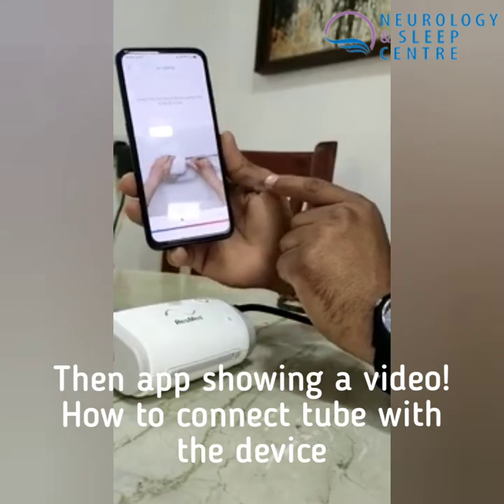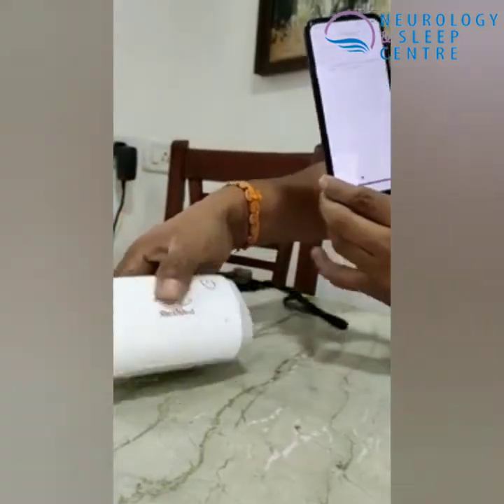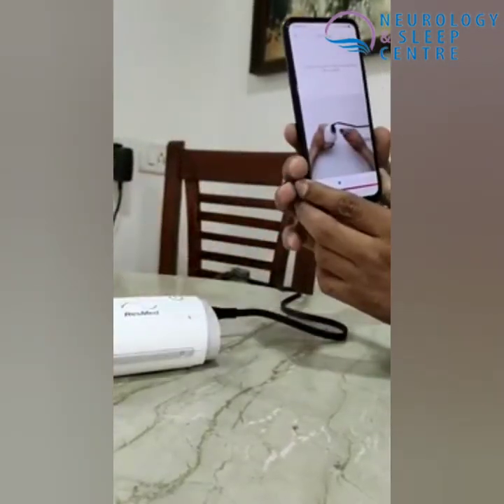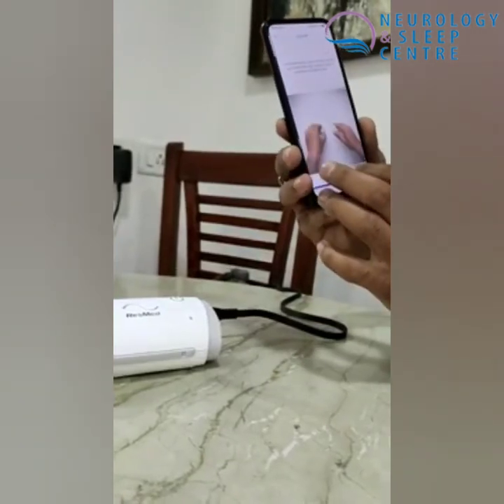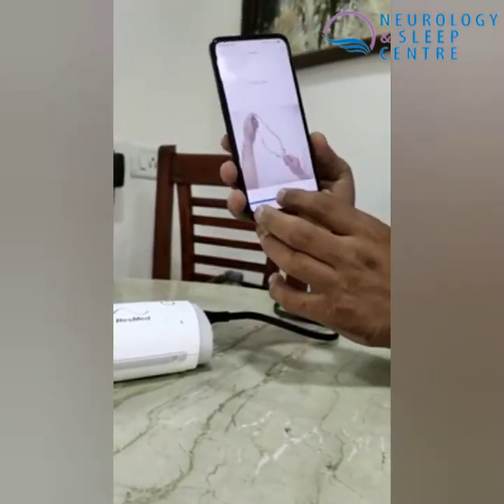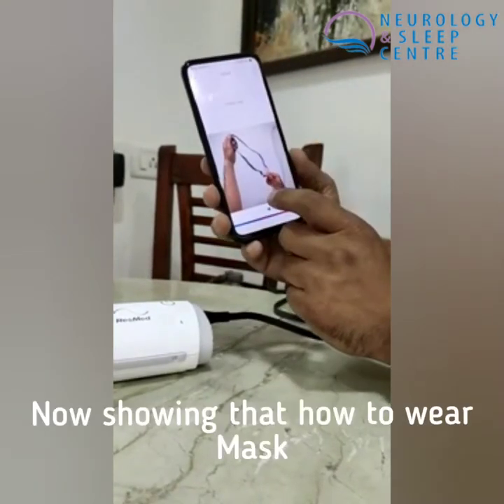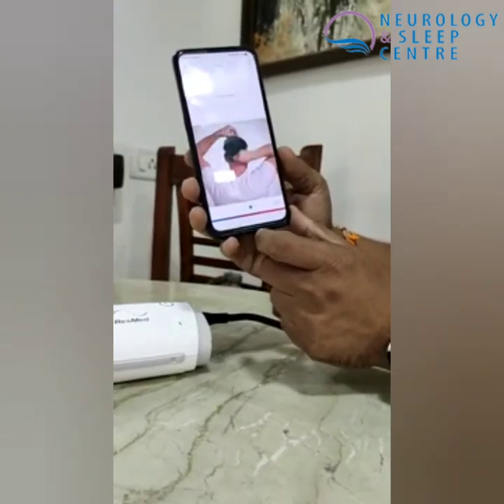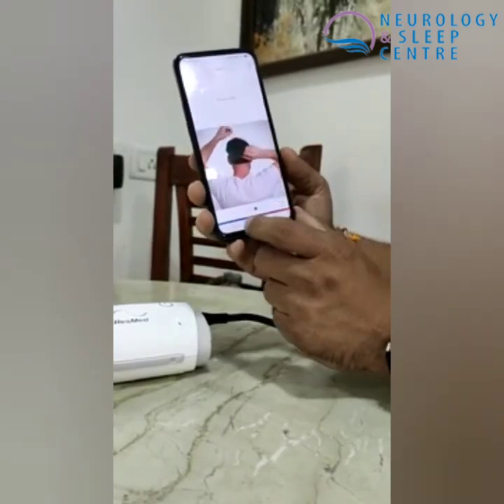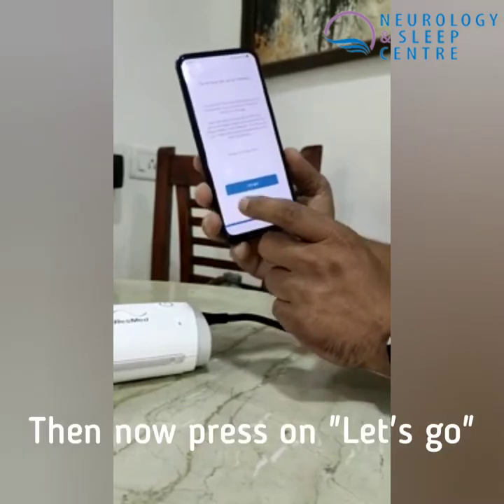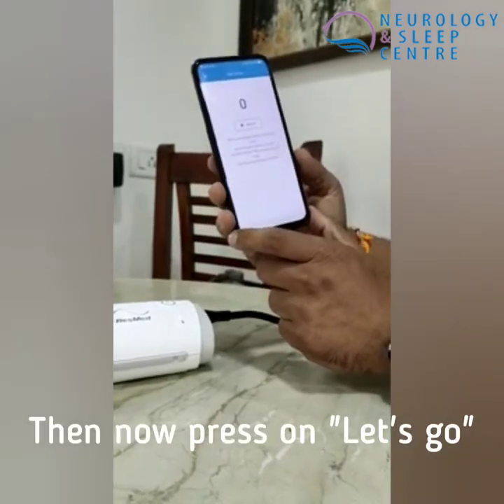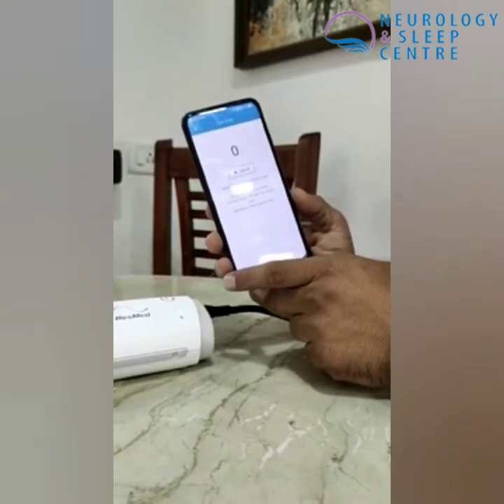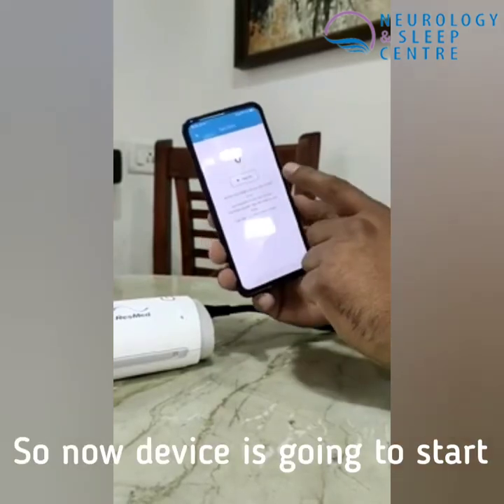Now the device is showing a video on how to connect the tube, where the on/off button is, and how to wear the mask. Now let's go — the device is going to start.